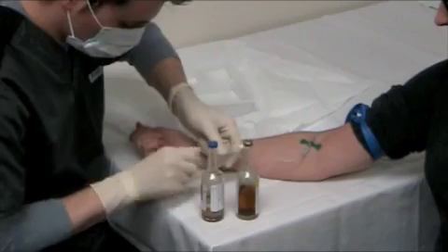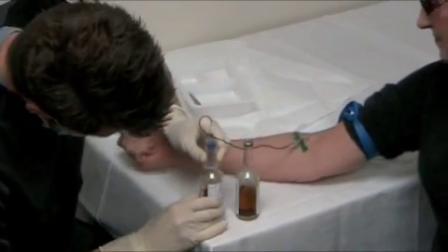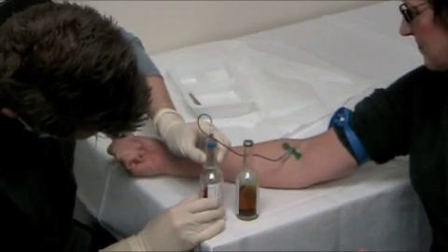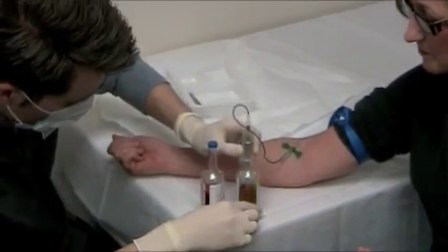Don sterile gloves immediately prior to venipuncture. Between 5 and 10 mls of blood should be collected per vial. Specimens for the aerobic vial should be drawn first, in order to prevent air from ruining the anaerobic environment.